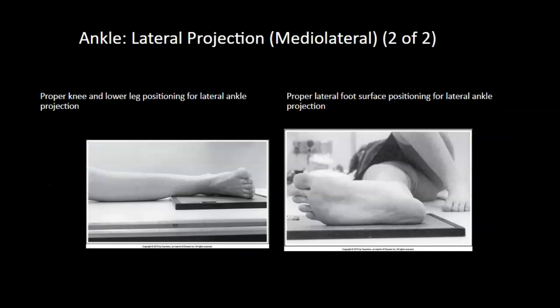The images I have here for you are just to demonstrate proper knee and lower leg positioning for the lateral ankle. Also, the positioning of the lateral foot surface. You want to ensure that the lateral foot surface is parallel with the IR to get a good lateral ankle projection.